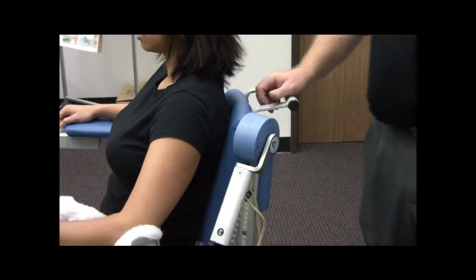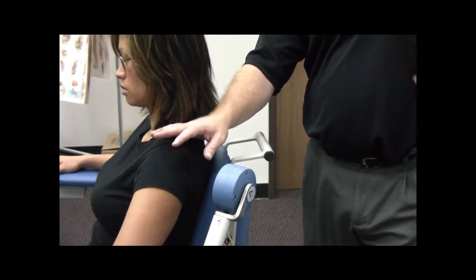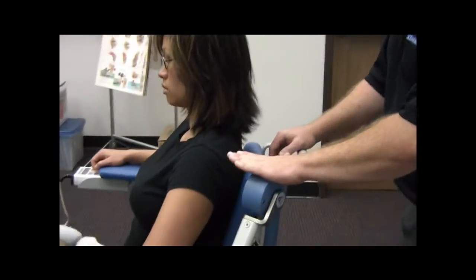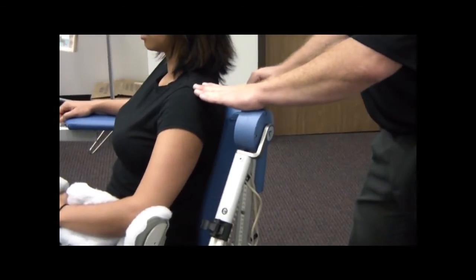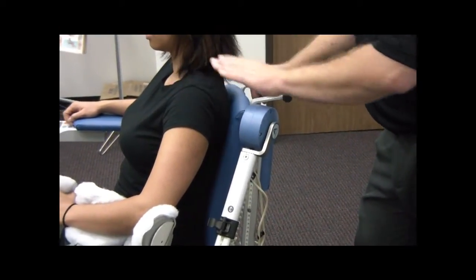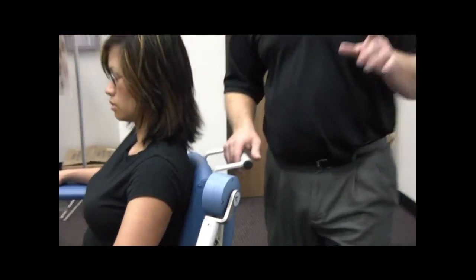Typically, if I go from the top of the motor, I should be able to line up with the top of the shoulder. Now, keep in mind, if you're setting up a patient after surgery, there's going to be a lot of bandages on there, and that can sometimes be hard to tell, but you can usually get an idea that the top of the motor and the top of the shoulder line up. Even if you have some bandages on there, you just have to keep in mind the thickness of the bandages. The other thing that needs to happen here is we need the patient to be even shouldered and comfortable. And if we have one, we should have the other.